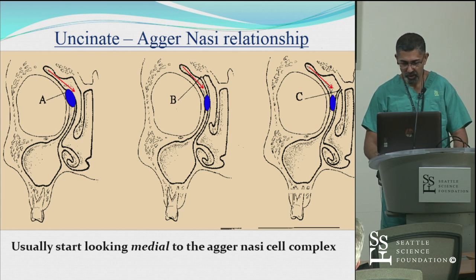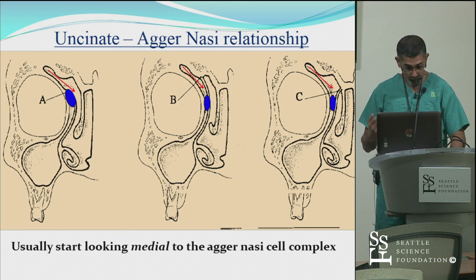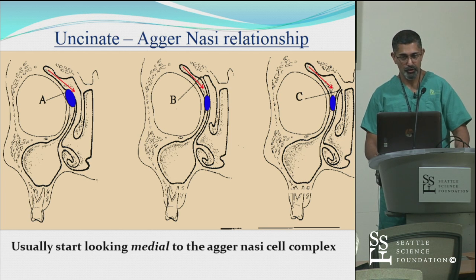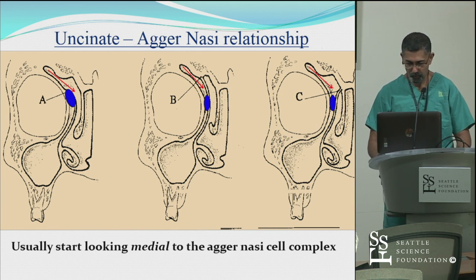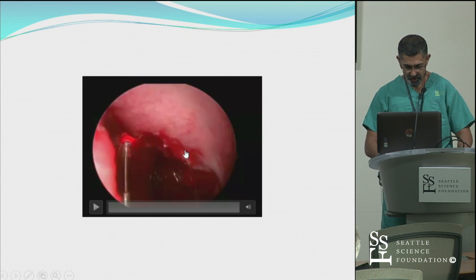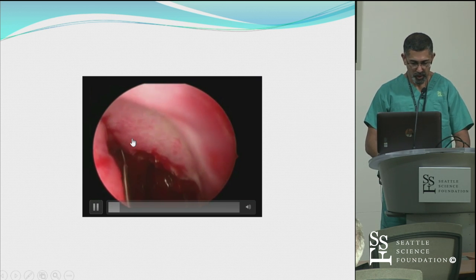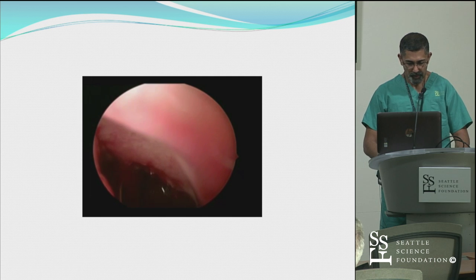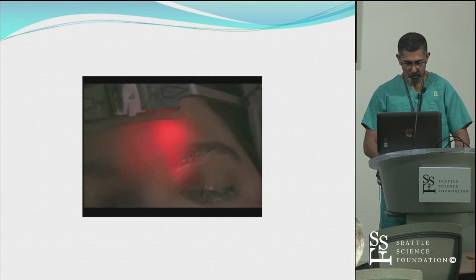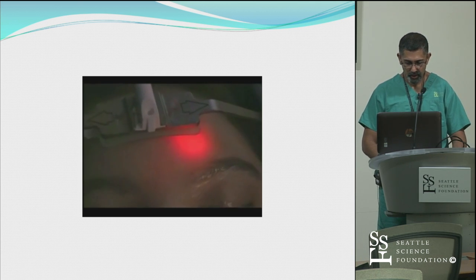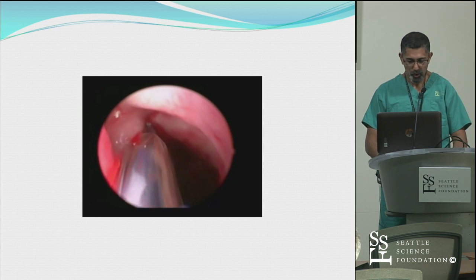What does that mean when you're looking for this with your balloon probe? You need to generally look medial, and your trajectory goes from medial to lateral, starting posterior and working anterior — so you're starting posterior and medial, working from there anteriorly and laterally. This is a nice video that shows that: here's the residual uncinate process, the balloon probe going posterior and medial, and looking forward in the forehead — again, it's important to see that point of dancing light as you manipulate the guide wire. Then threading the balloon over that.